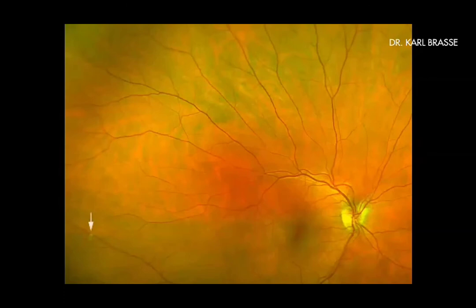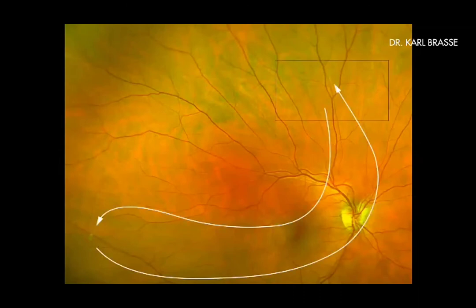Here you can see the flight path in low altitude across the central retina with any eye movement. In motion rest of the eye, the floater always returns to this position. The diagnostic in this case was difficult and really time-consuming. The treatment was even more difficult, in particular as the clump was close to the retina and out of the optical axis. Luckily I was able to solve the case successfully. The desperate patient had several consultations before in different practices without a proper diagnosis.